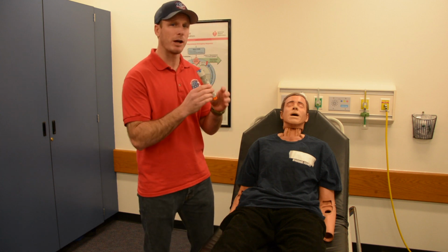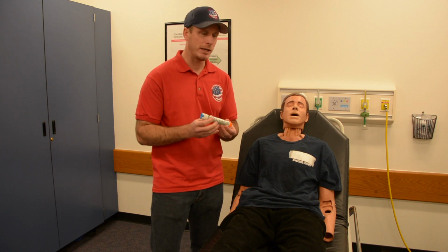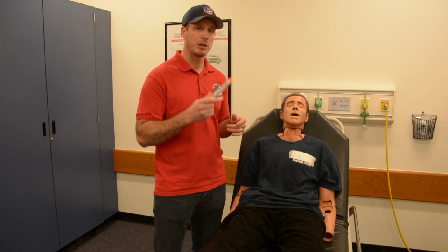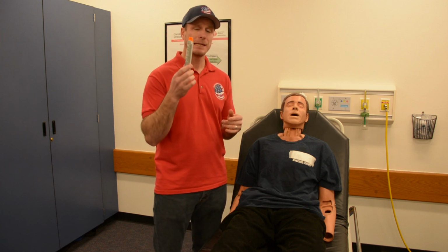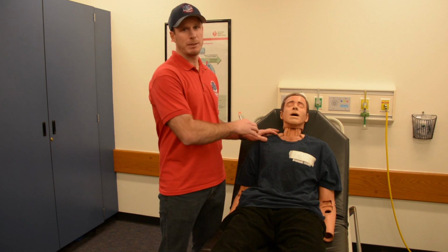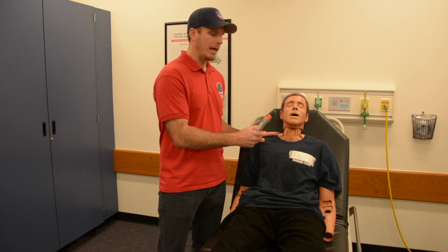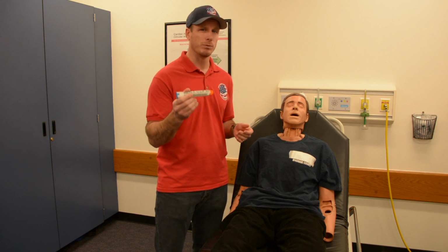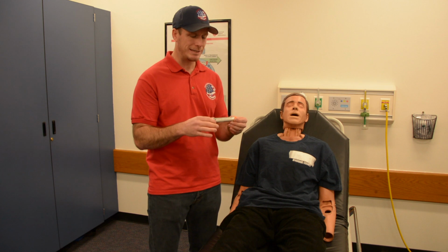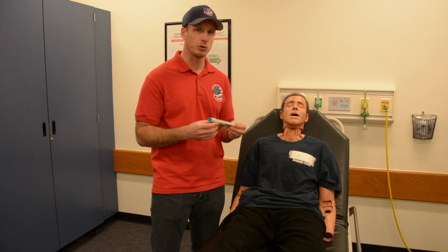Now, when we administer our epinephrine, we're going to tell our patient, hey, we're going to be administering your EpiPen. Our EpiPen can be carried with us in our rig or maybe in your med bag, or it can be administered to the patient, and you can assist them with their own prescribed EpiPen. We're going to take our EpiPen, make sure we do our six rights and DOCS, and we have approval from medical direction.